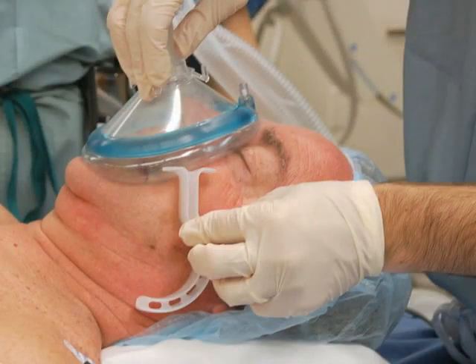If you continue to experience difficulty ventilating a patient, consider an oral or nasal airway. To choose a properly sized oral airway, hold the device against the side of the patient's face. The airway should extend from the oral aperture to the angle of the mandible.